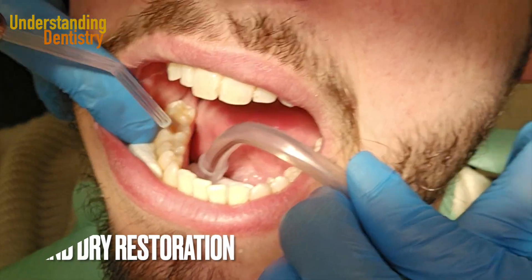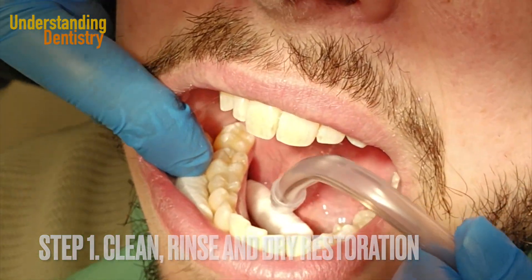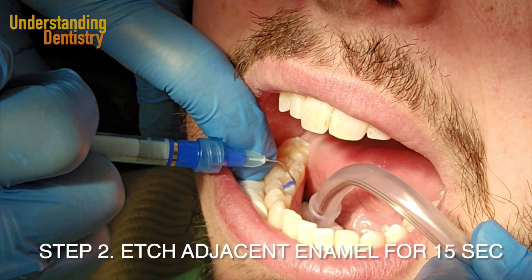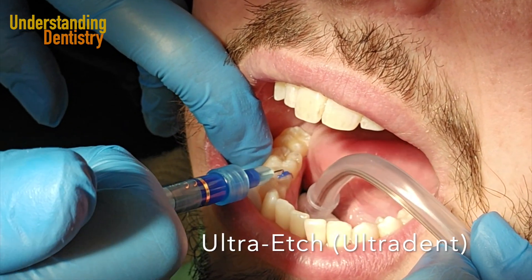The first step is to clean, rinse, and dry the existing restoration. Then we need to etch the adjacent enamel for 15 seconds with phosphoric acid. Here we are using the etching material from Ultradent.